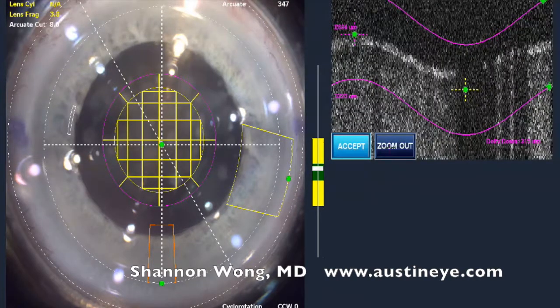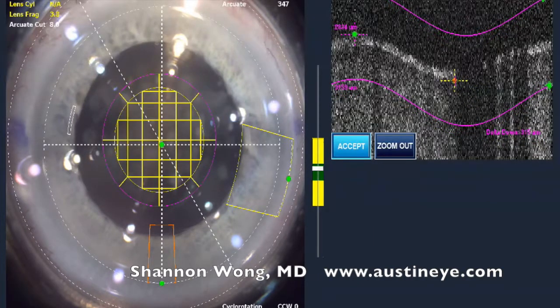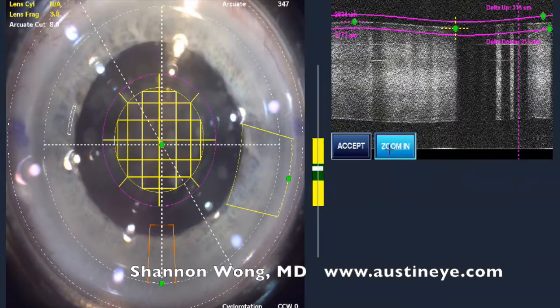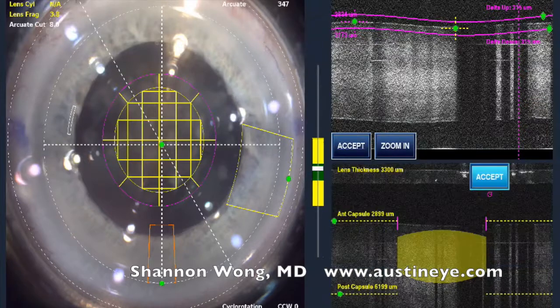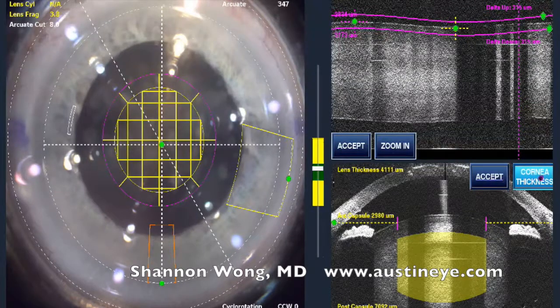You can see we've docked the LensX laser and we're imaging the capsule. You can see there are artifacts on the capsule and lens that are cast by the corneal opacities associated with granular corneal dystrophy. The lens has these black shadows, which are areas where the OCT cannot image the lens and anterior capsule quite right.